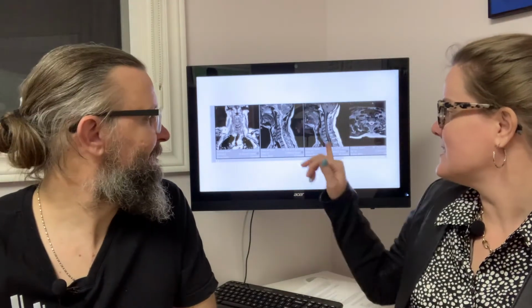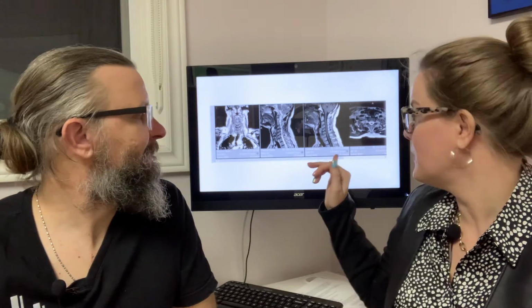Not a good thing. And this is the T1 window, which is the fatty tissue window. So fat tissue will show up bright white. So you see the tissue under the skin, the fat under the skin, fatty deposits in the body, etc. So yeah, it gives you really cool information. Very neat. Yeah, it's really neat.